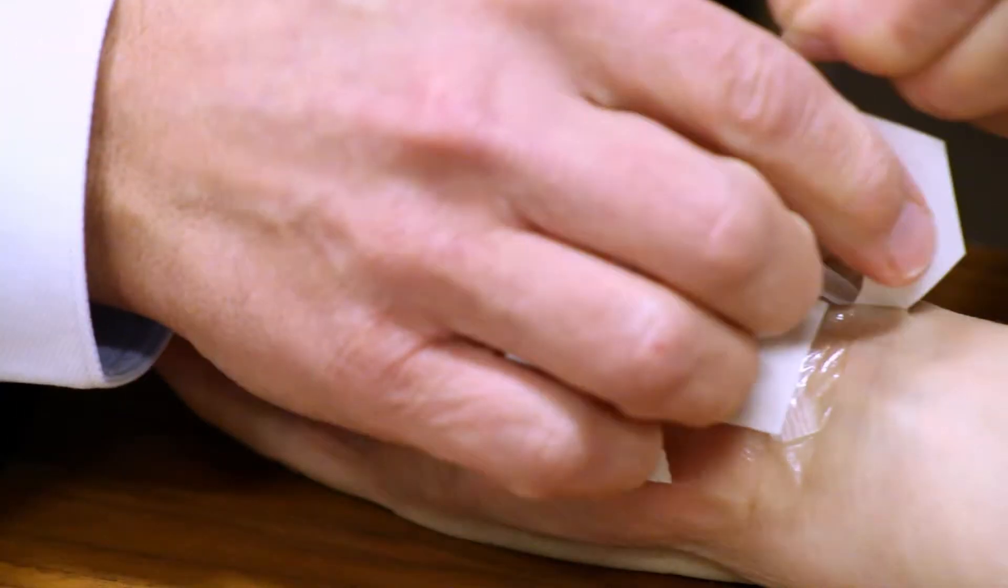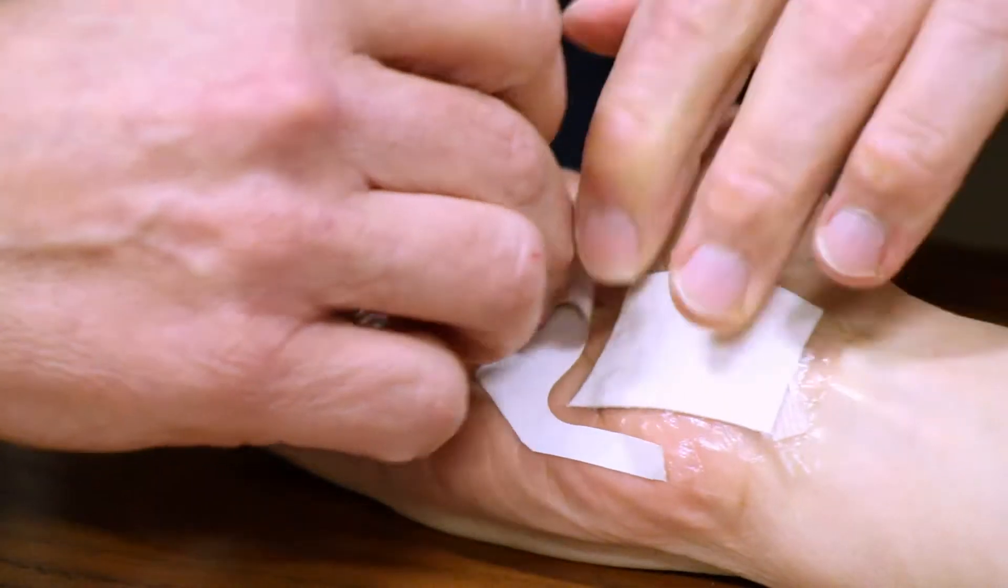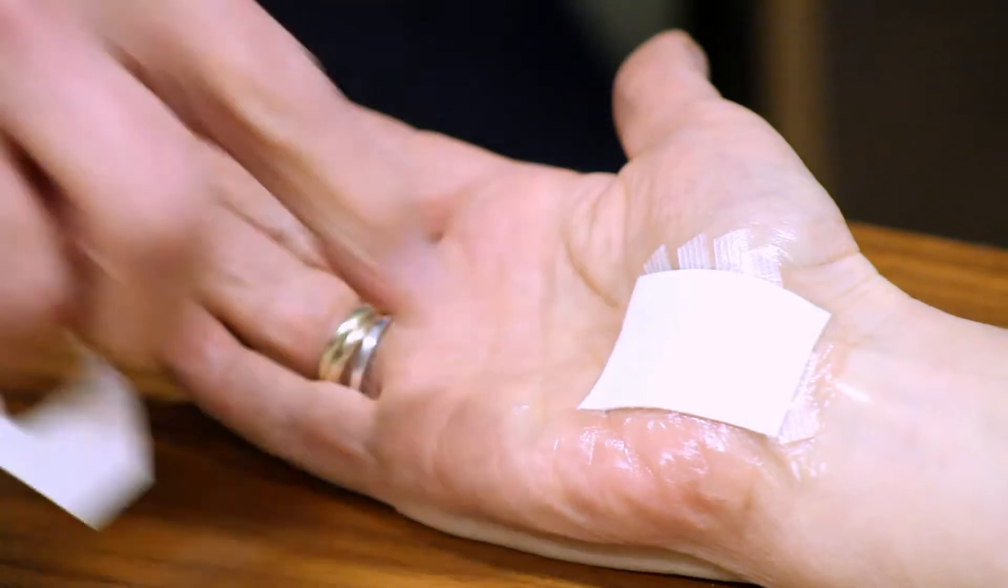The nurses will give you some of these on the ward if you ask them for some Tegaderm dressings. And they'll give you the right size for your operative site, with a little wound pad in here.